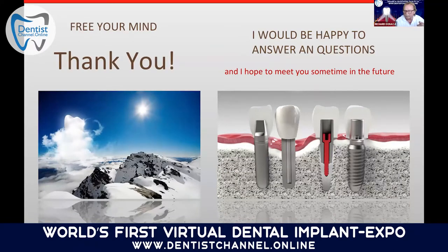If you would take our implant now and you would place it at the crestal level of the bone, then of course the implant is still going to get bacterial influence, especially if you don't have the soft tissue collar around the implant. So we might also have a case where the implant was not placed subcrestally, so that you don't get this bone closure and bone collar around the implant, and you have, let's say, a thin tissue type patient, then of course that bacterial influence is going to cause some peri-implant influence on our implants. So I think it depends on the connection and how deep or how safe you put the implant subcrestally, and how much soft tissue you have to promote the sealing around the implant connection.